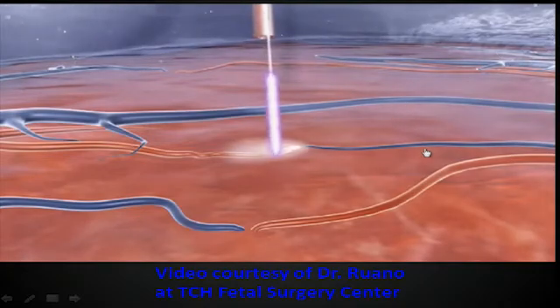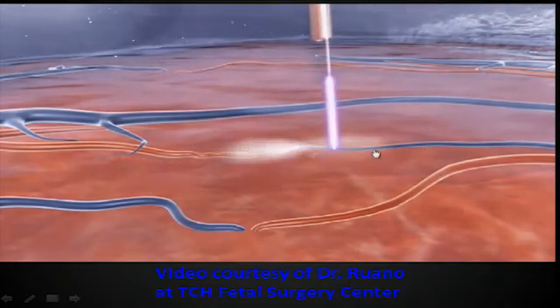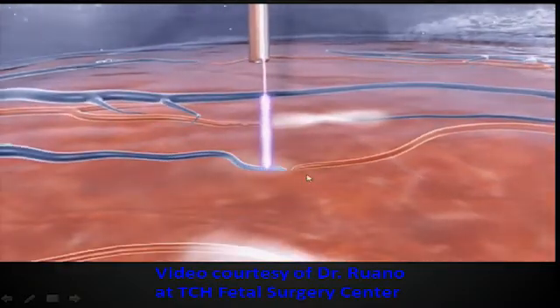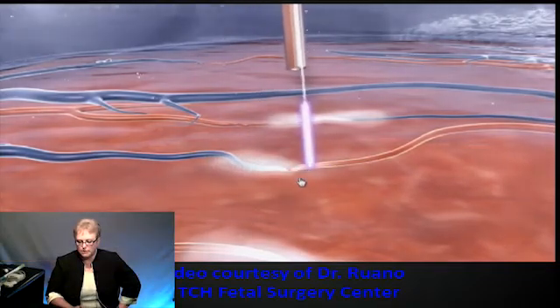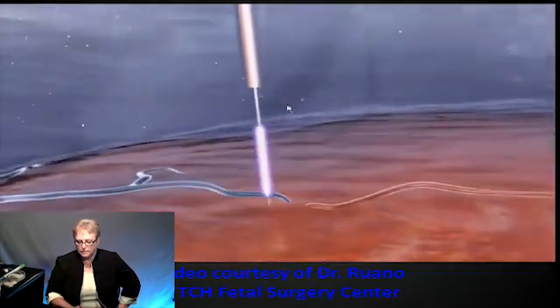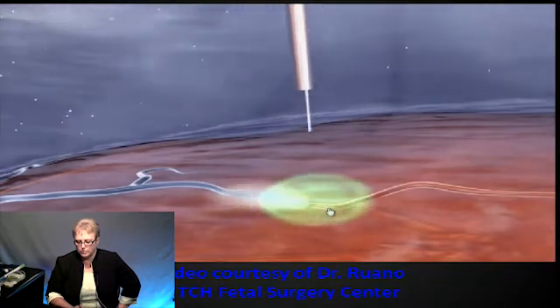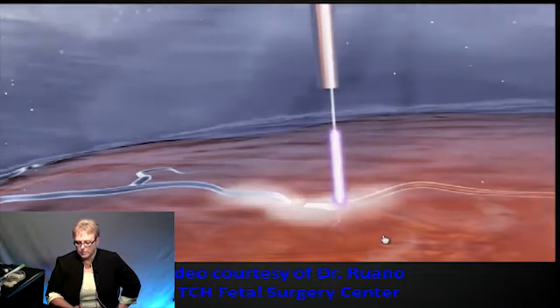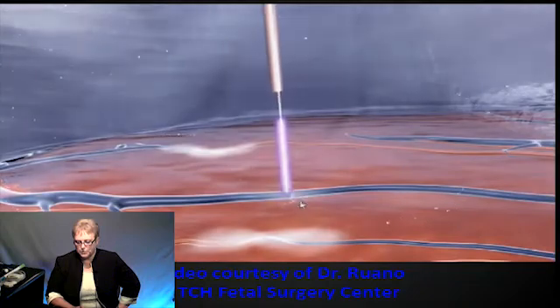So they'll zap the main vessels, the big vessels. So this is venous to artery, venous to arterial. So you can see these little lines. We'll do this one too, venous to arterial. And he's going to come back and zap this big one too.